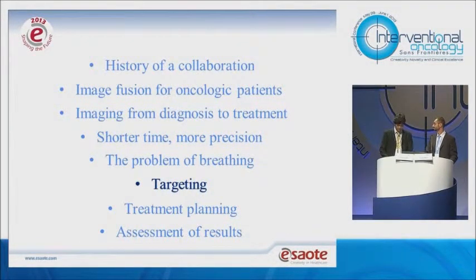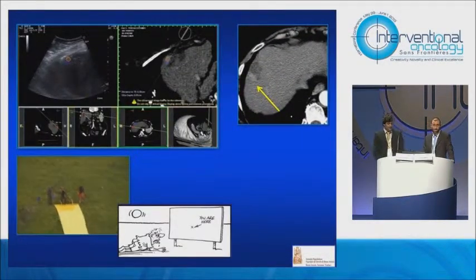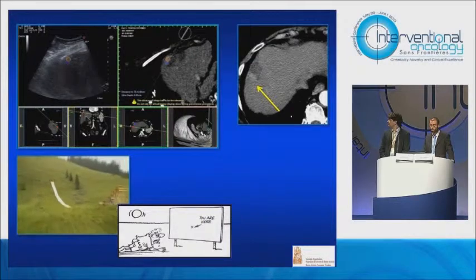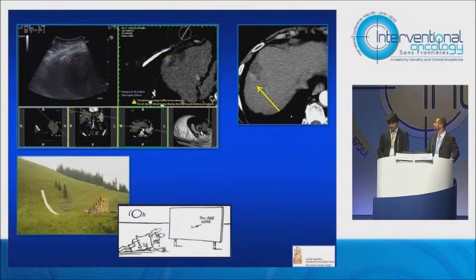Targeting. Now we move to the problem of targeting, and we will see what the new features in this field are. Of course, targeting is absolutely crucial. Sometimes you have small lesions or small recurrences that you can see only by CT.